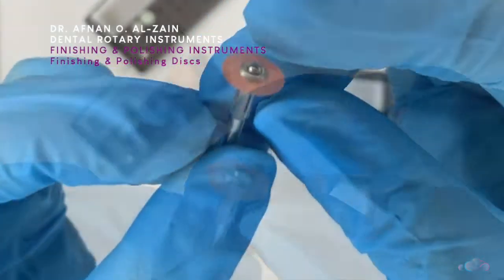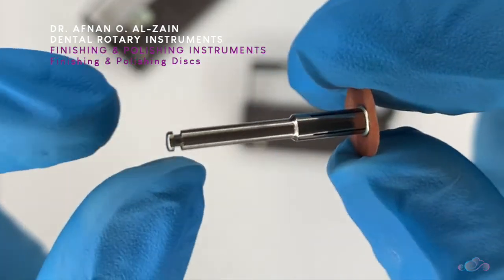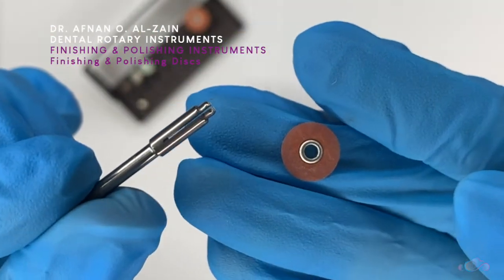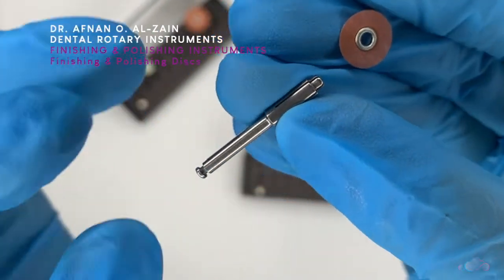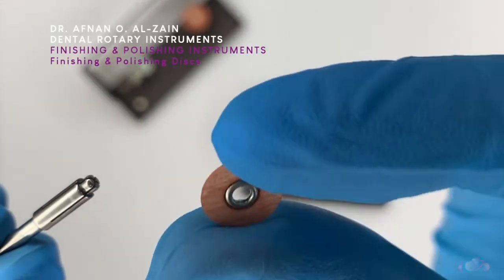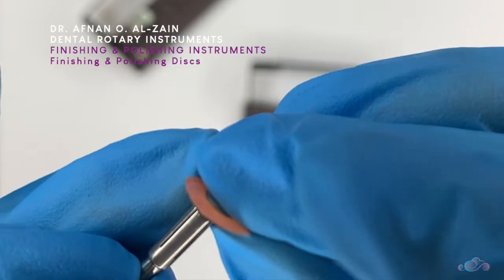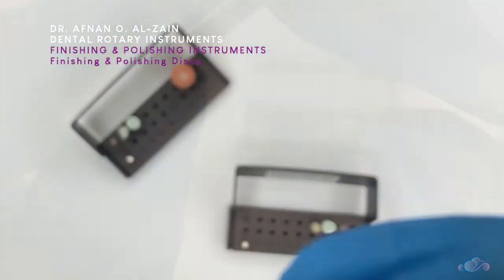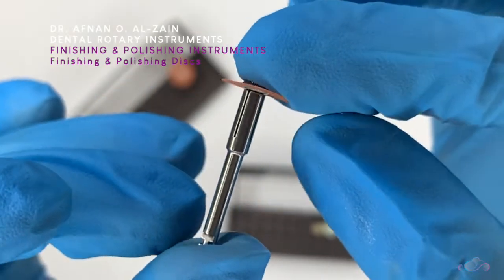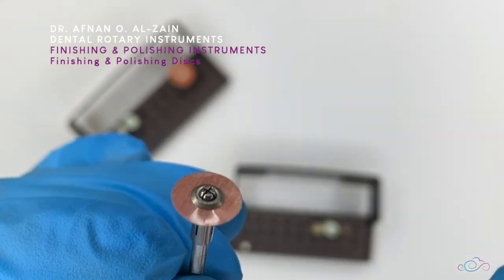Moving on to the finishing and polishing discs. This is the disc, and this is the mandrel. It comes in a kit, and we're going to explain it in detail in a separate video. The mandrel attaches to the handpiece and the disc snaps into it. The discs come in different sizes and different grits — you just snap it in, and it will be attached for use.